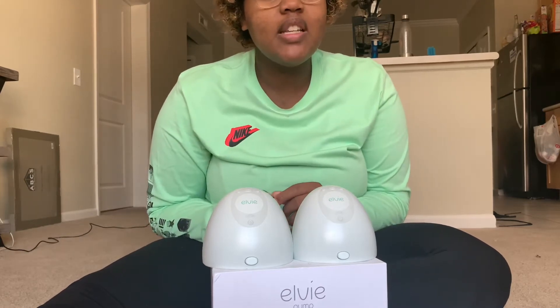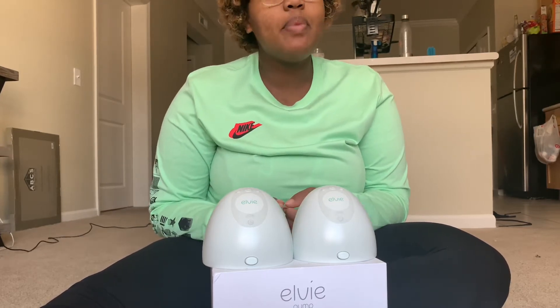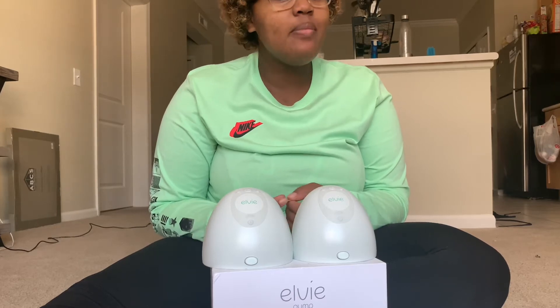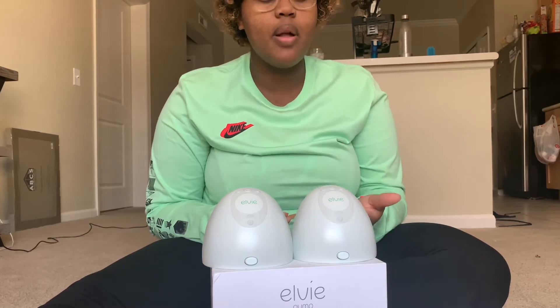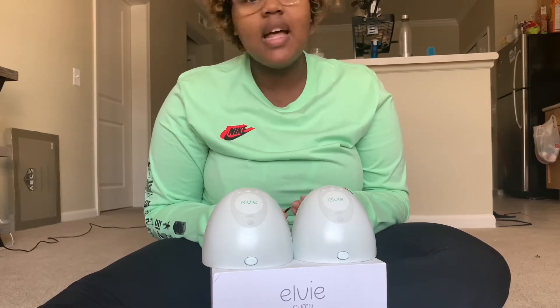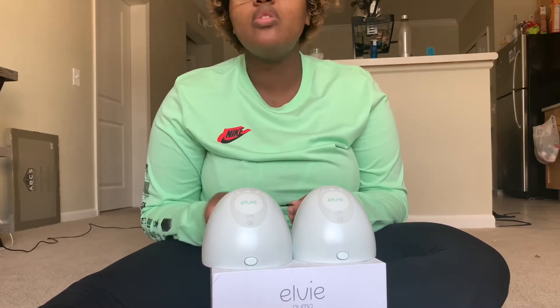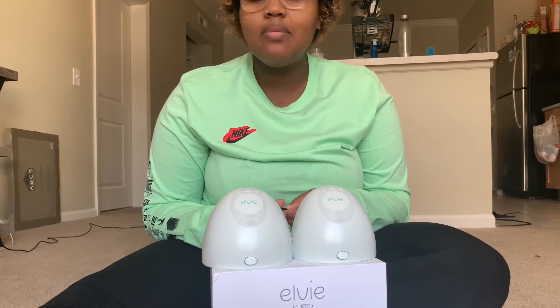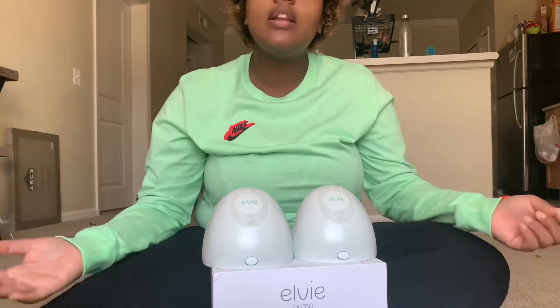First things first — it literally has to be in a perfect condition to work. So if your breasts are really small or really big and don't fit into the 24 or 28 flange, you don't have the perfect condition already, making it even harder to get the ounces you'd normally get. Also, it is not a hospital-grade pump, so you're not getting out the amount of ounces you would from a hospital-grade pump — at least in my experience — which is really disheartening when you're exclusively pumping and need every ounce.